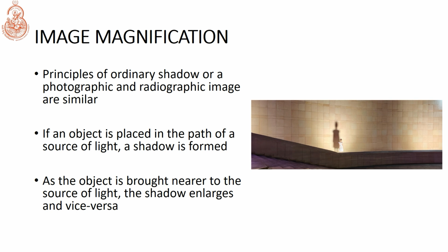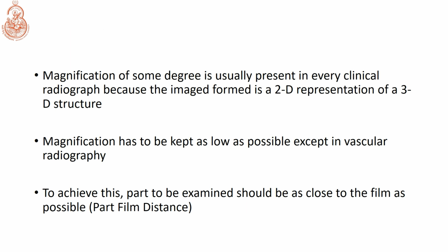So this is very important when we talk with respect to radiology. Image magnification shall be kept as minimum as possible.